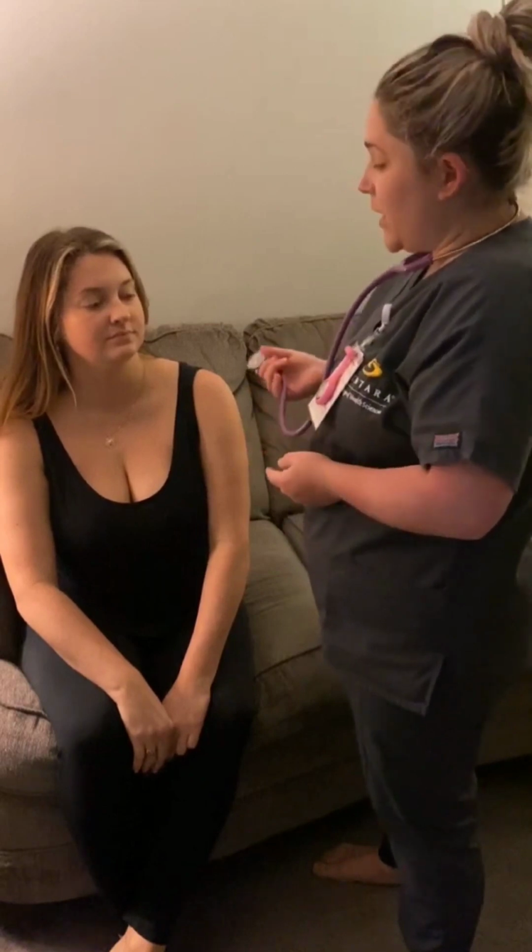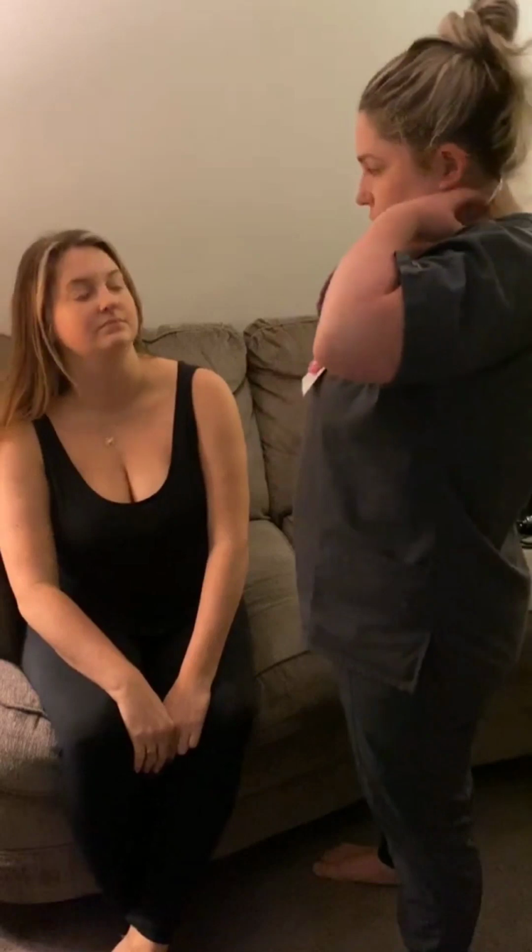Take a listen to your lungs. I'm going to listen on the front and the back. And every time you feel my stethoscope on your skin, I'm going to have you take a deep breath for me. And usually I would do this directly on your skin, but under these circumstances, I'm going to listen through your clothes, okay?